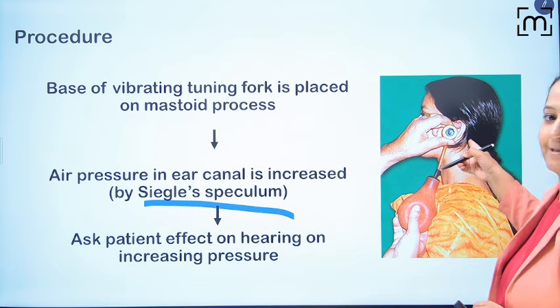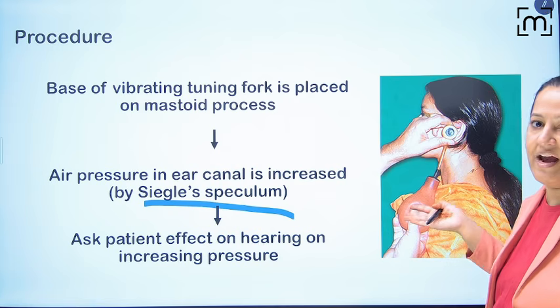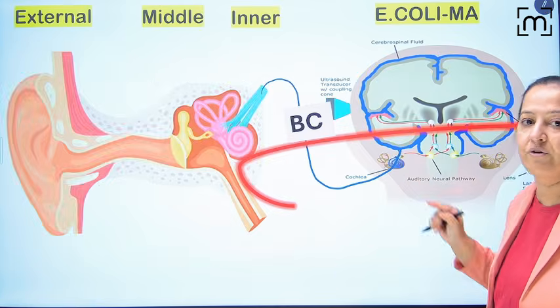Can you see this is Siegle's speculum? I will put this instrument in the ear and increase the pressure and see whether the patient is hearing better, the same or worse on increasing the pressure.